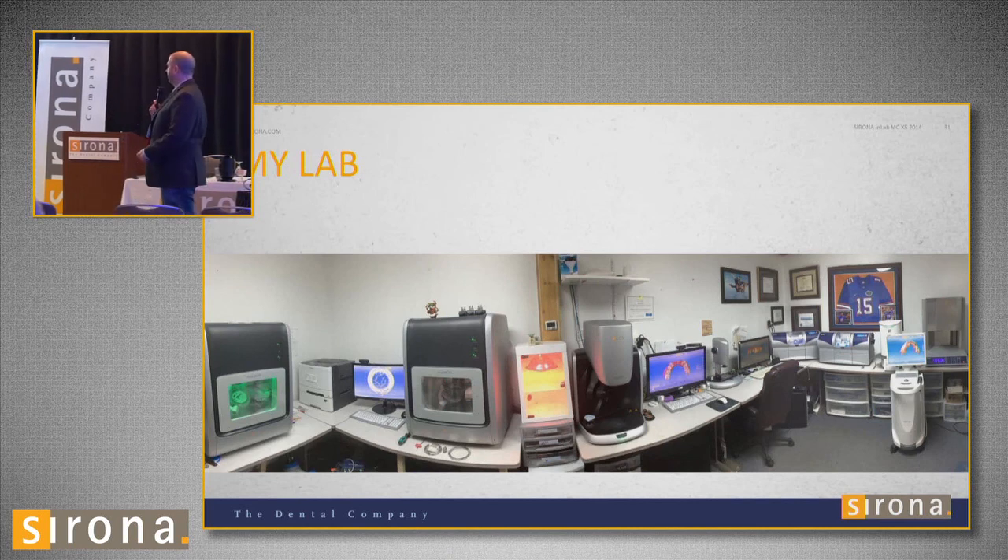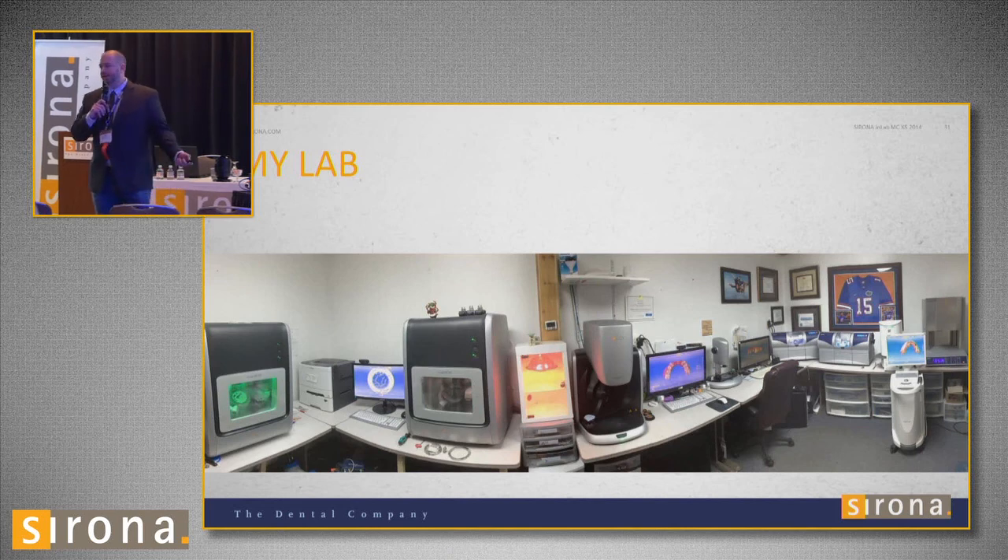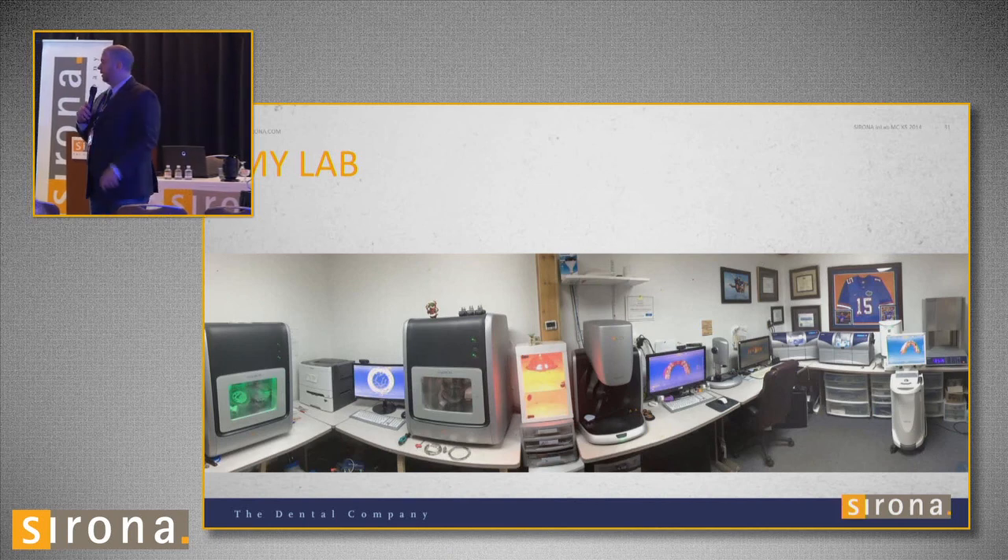Here's my lab — the main heart of it, my cave where I spend most of my time. We have one X5 scanner, an Ineos Blue I haven't used in a couple of years, and I've bought an Omnicam that I take out to train dentists on. That's also how I get Sirona Connect clients — I'll teach them how to use the software and their machine. I also take it to different dental offices and do same-day cases. I have two MCXLs. My MCXLs just mill Emax all day long. I'll never get rid of them because I can mill an Emax in 10 minutes.